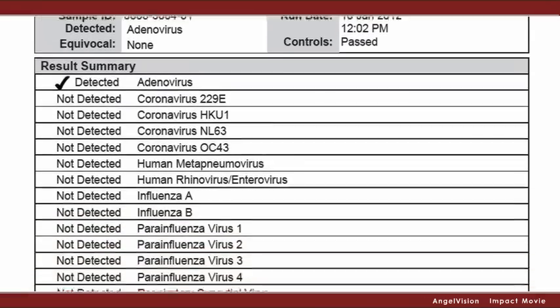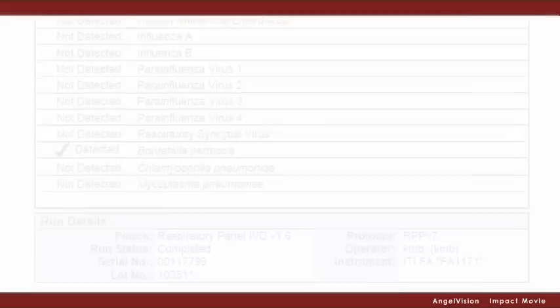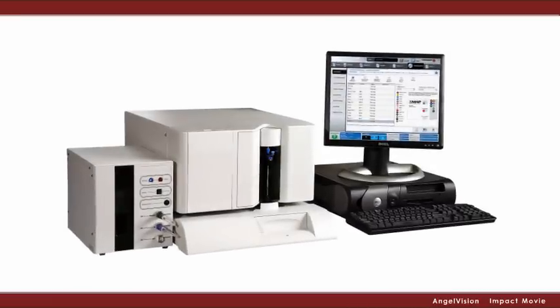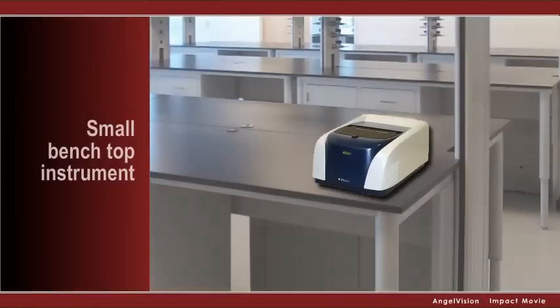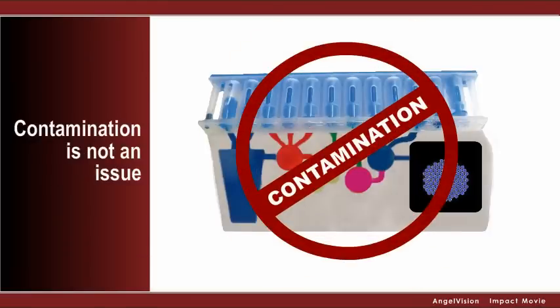It's that easy, thanks to the sophisticated software that analyzes all the data into an easy-to-read report. What's more, the Film Array is FDA-cleared, and unlike typical molecular testing systems that require huge and expensive lab reconfigurations, the Film Array is a small benchtop instrument. And since the Film Array is a completely closed system, contamination is not an issue.